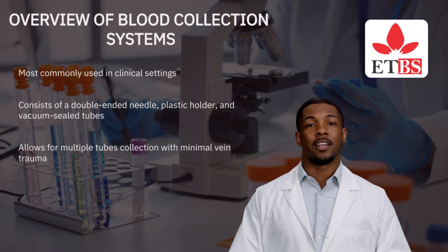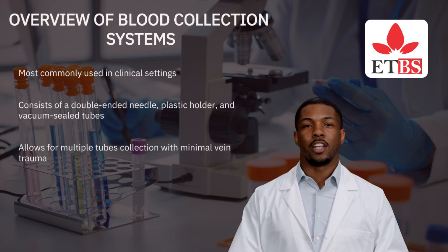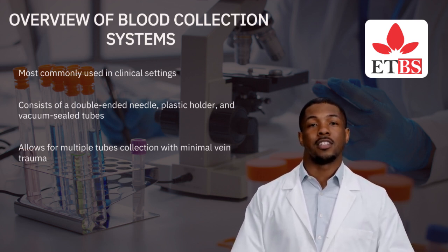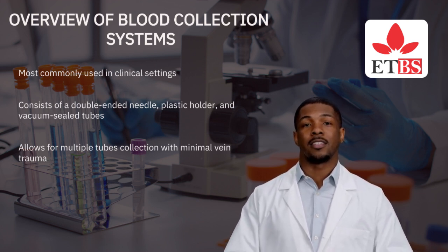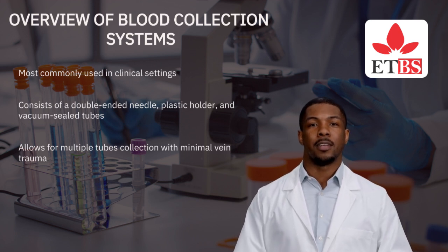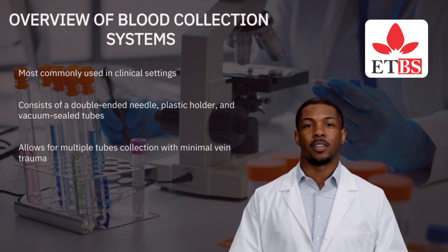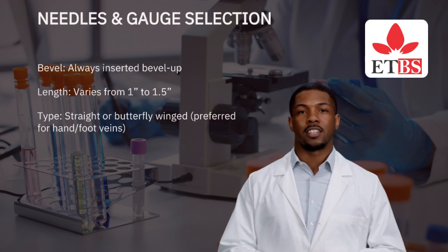2. Syringe system includes sterile syringe with plunger and hypodermic needle used for fragile veins or small veins, e.g., elderly, children. Advantages: better control of suction pressure. Disadvantages: higher exposure risk, requires transfer to tube. 3. Capillary collection system uses lancets and micro collection tubes, suitable for neonates, infants, burn patients, or those with poor venous access.